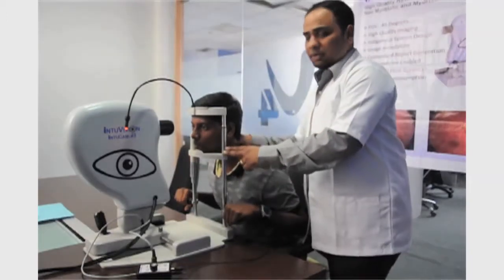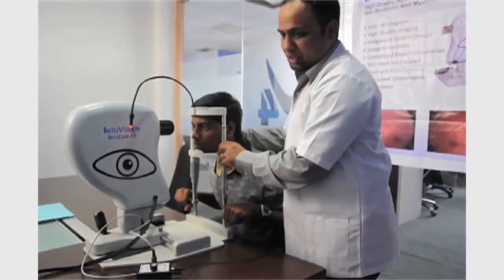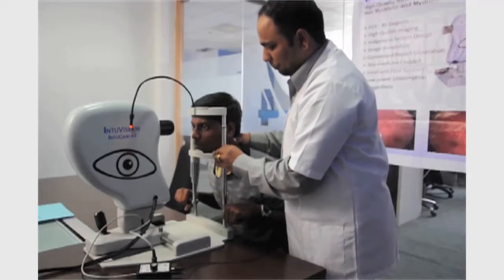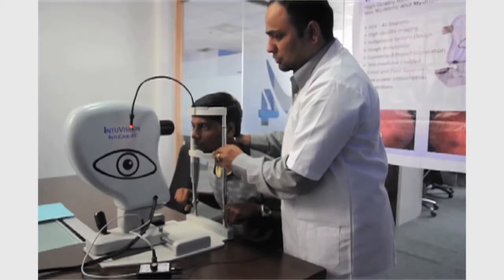Once it is done, align the external fixation, and if you are examining the right eye of the patient, tell the patient to look at the external fixation light with his left eye and vice versa. It is always better to tell the patient that they will be experiencing a small flash when we capture their image.